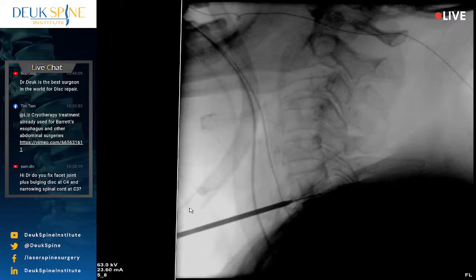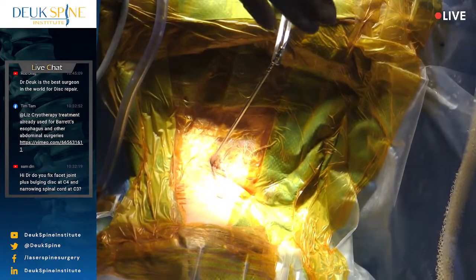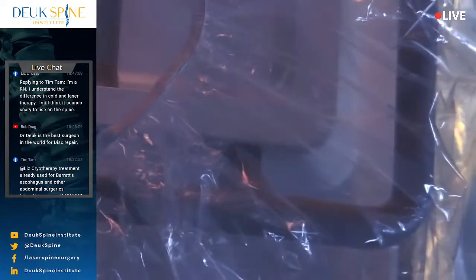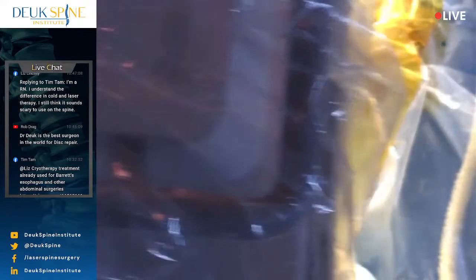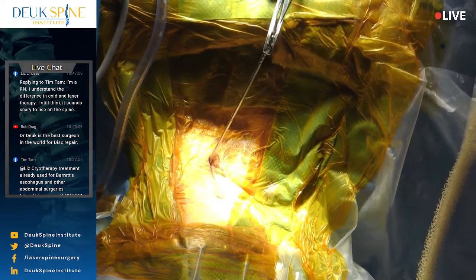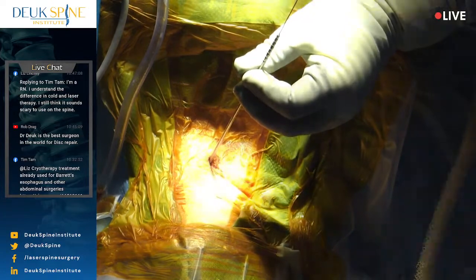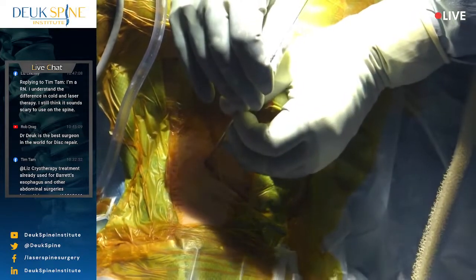Let's get an AP. I want to make sure I'm on the ALL, anterior longitudinal ligament, so it's safe. Because if you go off the ALL into the longus coli muscles, you could be asking for a lot of trouble. You can get bleeding. Yep, we're perfect in the center. You can see the guide wire goes beyond the center to the foramen that we're headed towards. So at this point, everything is going perfect. Couldn't be better. We've lost 3.5 drops of blood. All right, so now I'm going to advance, and we are at the correct level.